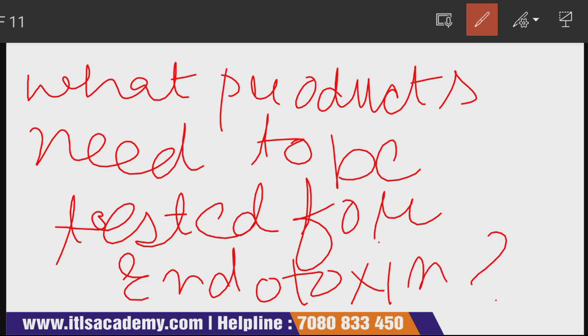The answer for this is all the injectable pharmaceutical products, cell and gene therapy products, the medical devices, or you can say the dialysis products. Even some of the food products are products that need to be tested for endotoxins.